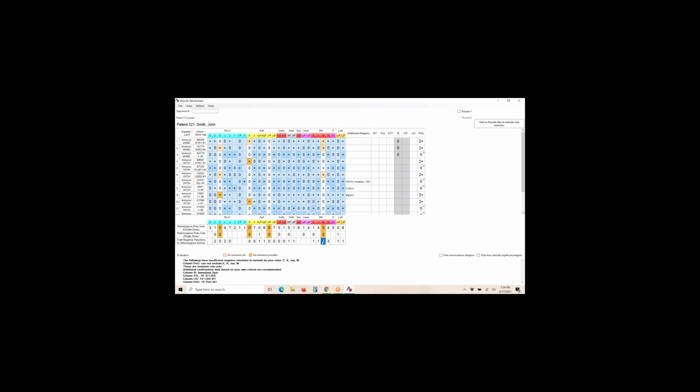And since there isn't one yet, it's going to conflict with the K, so it can't say, well, this 2+ reaction is because of this most likely. It's basically saying maybe, but we're not sure which one. And any place that you see the orange, you're going to see light orange, you're going to see another light orange across from it, or more. Sometimes you see more than one. See multiple, 3 or 4 of them, or 5.